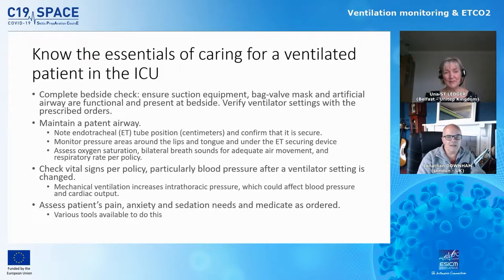Okay, so I've been asked to cover ventilation monitoring and carbon dioxide. It's important to be aware that when you're looking after a ventilated patient in the intensive care unit, there are a number of routines that you will be doing throughout your shift. These are going to be done with all of the ventilated patients, and they become something that we do very regularly, 24 hours a day.